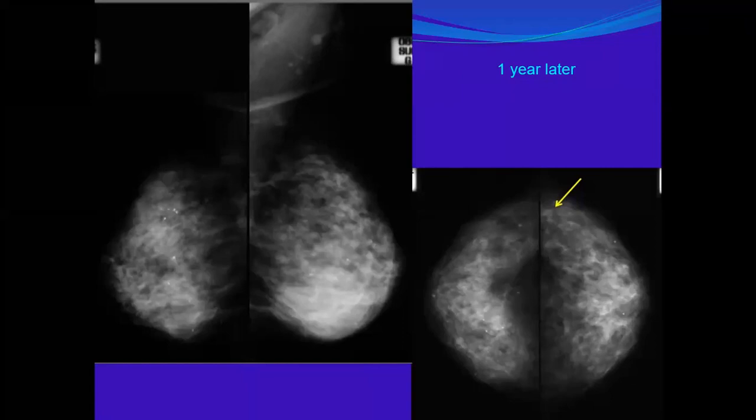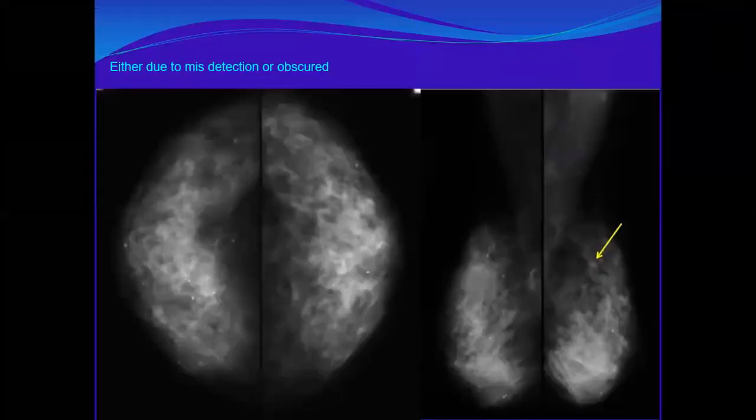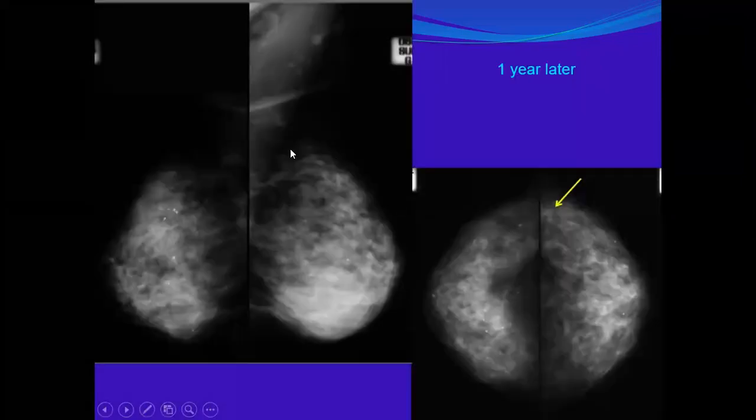Different what? Yes, you are right. Both of you are right, because there are different techniques of positioning. It is related to mammographic positioning and compressions. From time to time, the breast is pendulous and moving, so the directions and amount of compression, as well as positioning, might differ from one to another. Even if you look here, the pectoralis is high up in this mammogram and a little bit lower here. So there is definitely a difference in positioning.